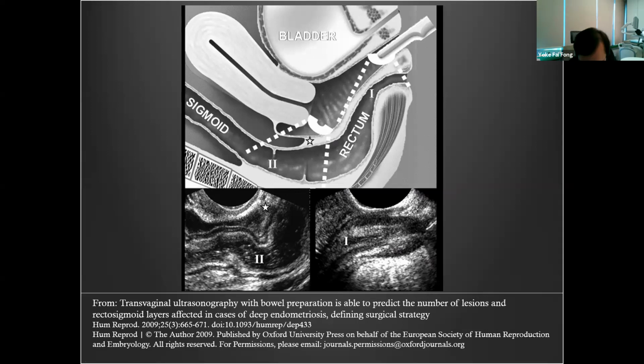Okay, so when you do a so-called transvaginal mapping, you actually start at the lower vagina, especially when you want to look at the rectovaginal septum, right? Usually, lower down, the vagina and the rectum are free of disease, so it's a very good place to start tracing from normal to abnormal. When you put in the probe, you can start from the lower vagina, where you can see the rectovaginal septum and the rectum. Usually they'll be very smooth, and you can slide against each other.